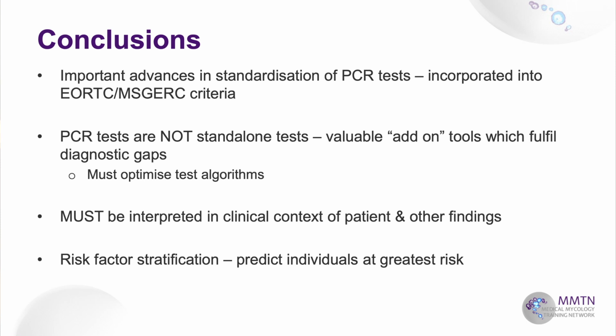It's really important that all PCR results are interpreted in the clinical context of the patient and other findings, particularly if your patient's receiving anti-mould therapy. A negative Aspergillus PCR may not actually be that meaningful. So it's really important that we perform risk factor stratification. So we want to predict the individuals at the greatest risk, in whom a positive PCR result actually carries the greatest weight.